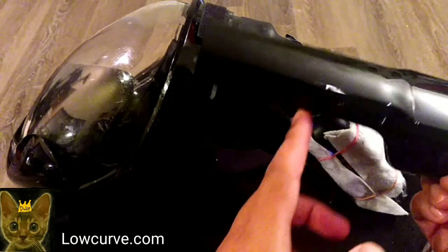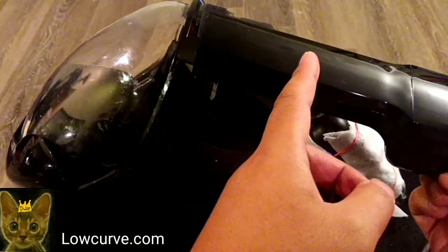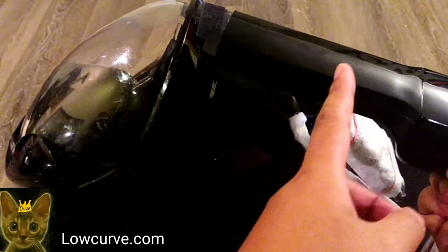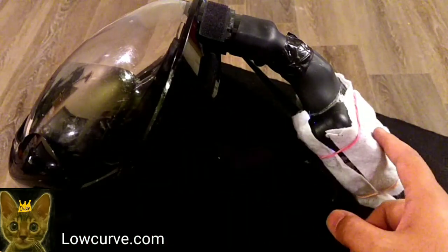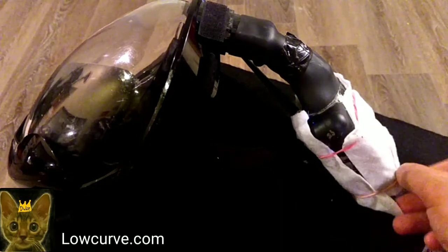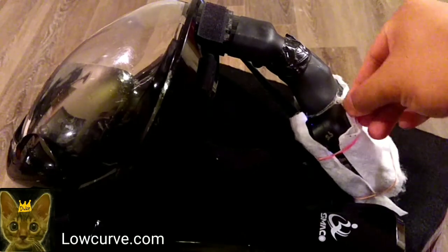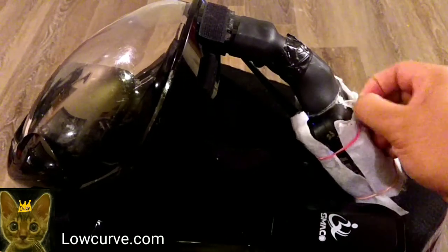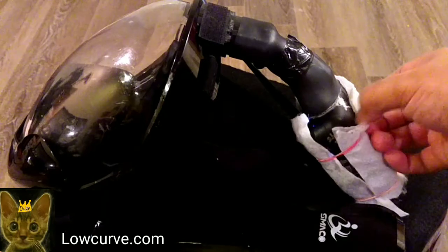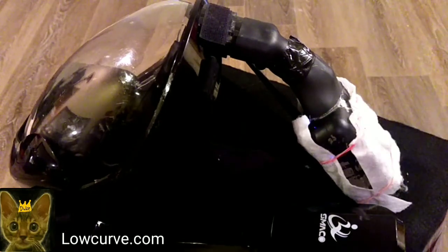Instead of having to add this and the piping, you could just skip all that by adding the snorkel, using a Dremel, which is a tool that costs more than the mask itself. If you already have a Dremel, you can cut off a portion of that and then attach it to the intake module. The intake module is a clip-on fan that you can get on eBay for like 20 bucks. You're supposed to clip it to your waist to provide air if you work outside and it's hot.